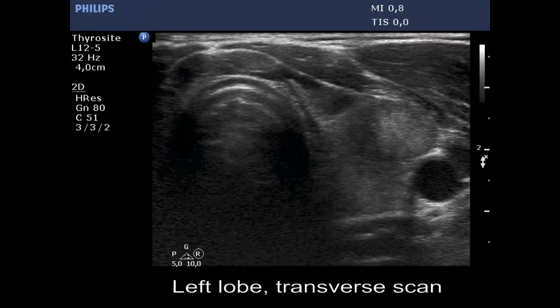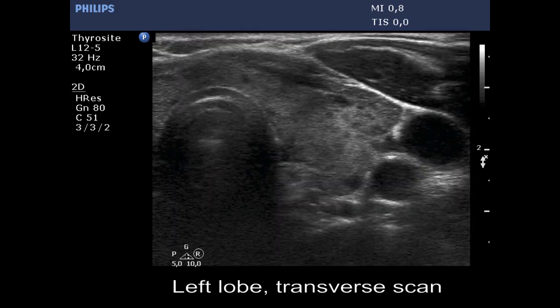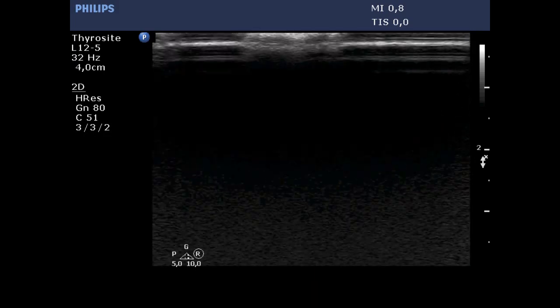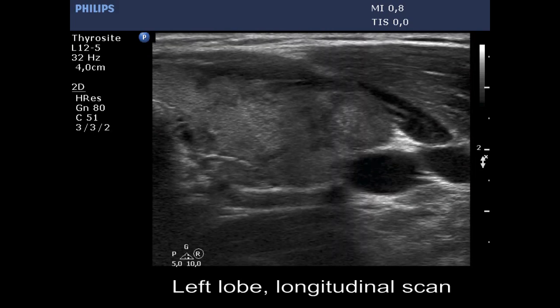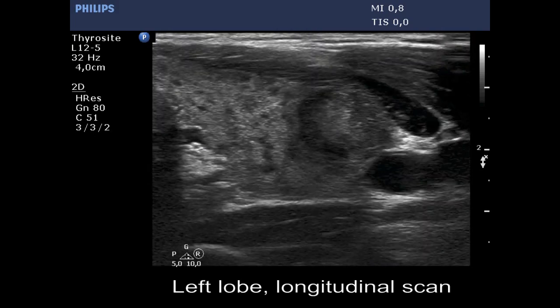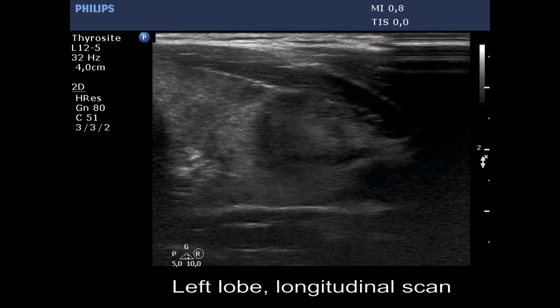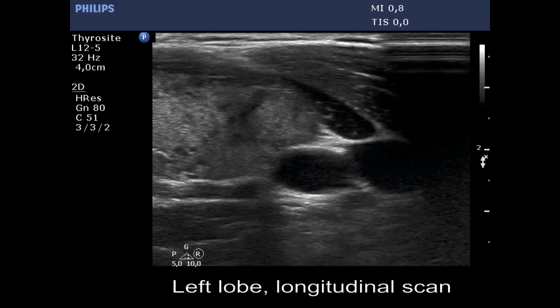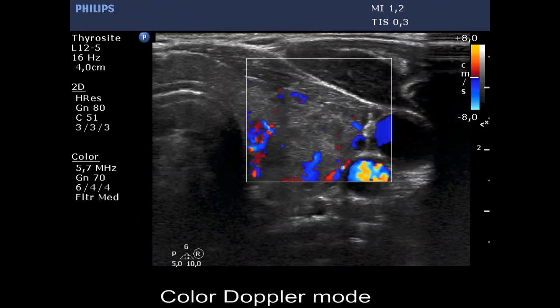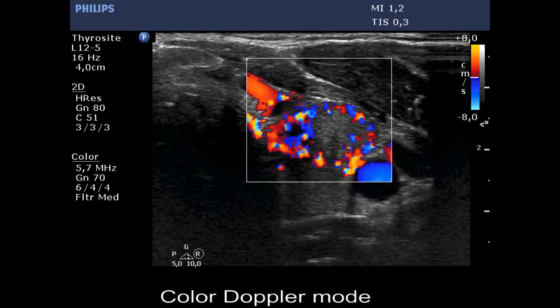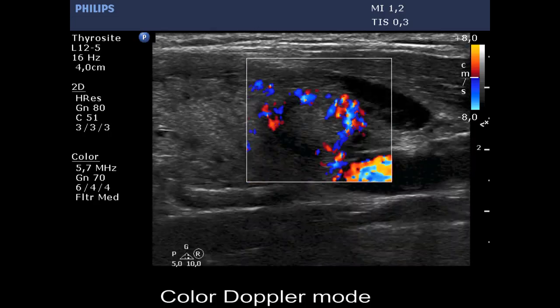The left lobe has a similar presentation, but there is an isoechoic lesion in the ventrolateral part. The nodule shows abutting and bulging contours and has microcalcifications. It has a dominantly paranodular vascularity, though intranodular flow is also increased in certain parts.